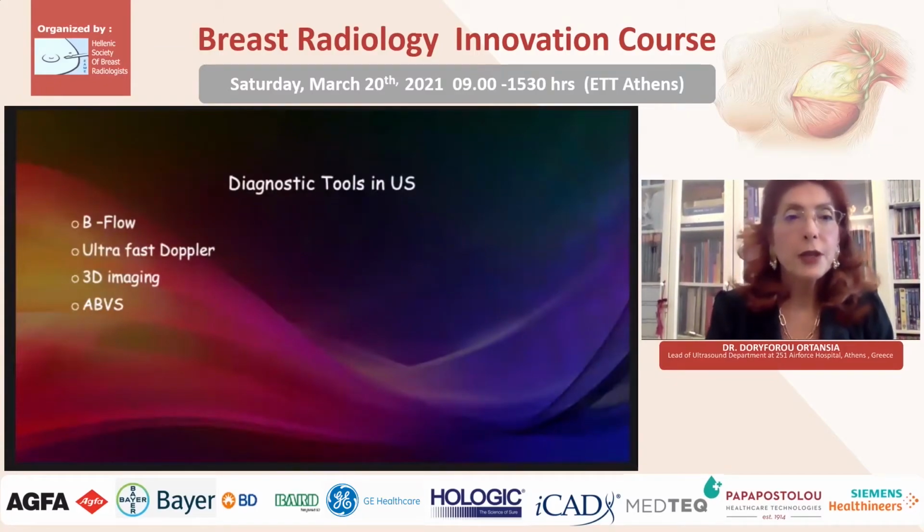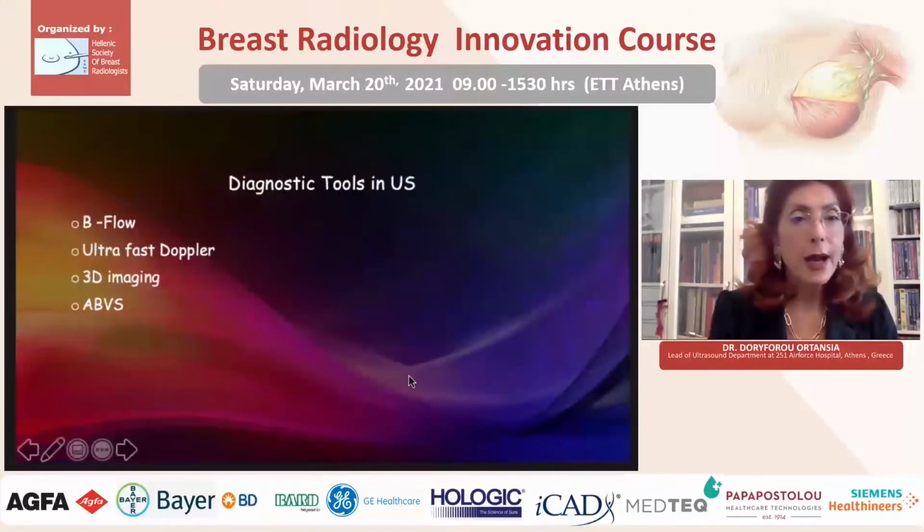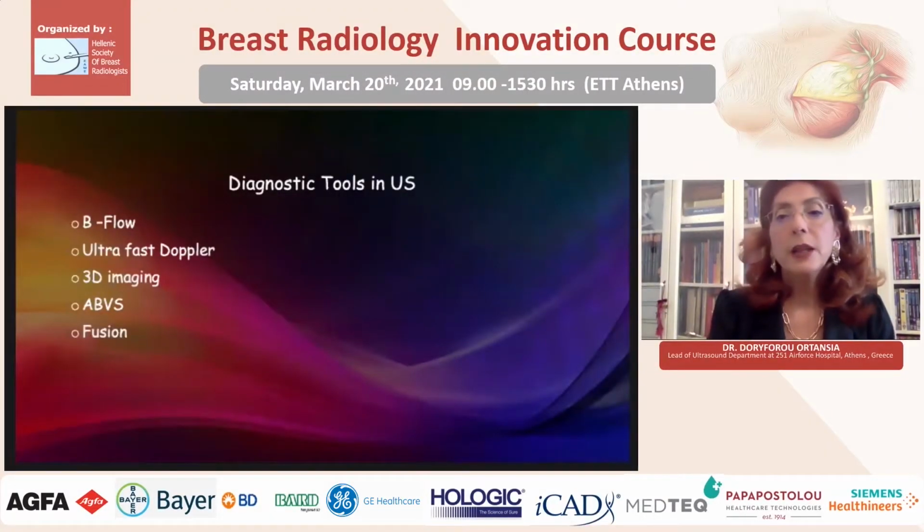ABVS, which of course is operator independent, and again, it allows 3D imaging. Fusion with MRI can be used in dedicated cases for second look ultrasound and potential biopsy.